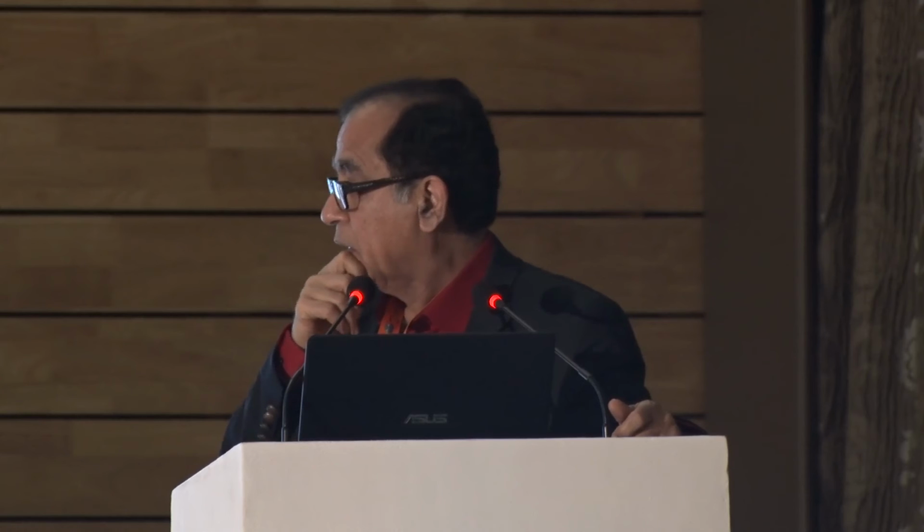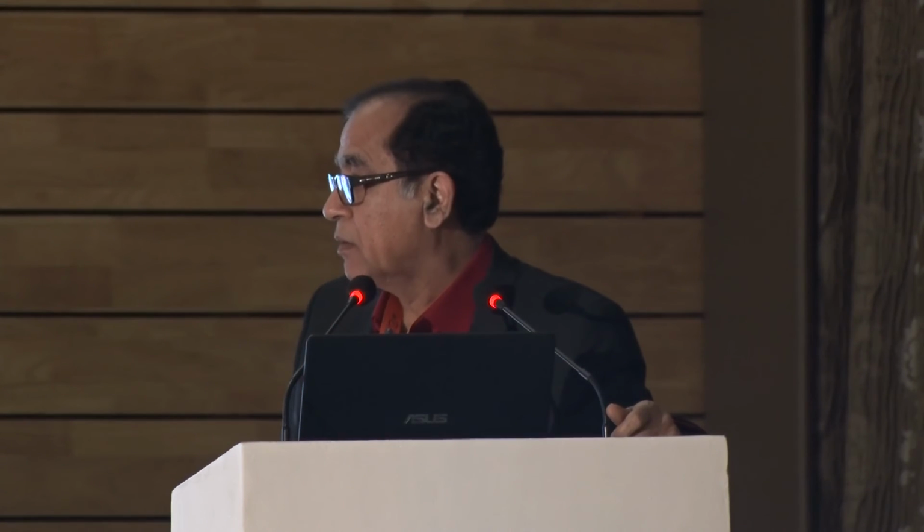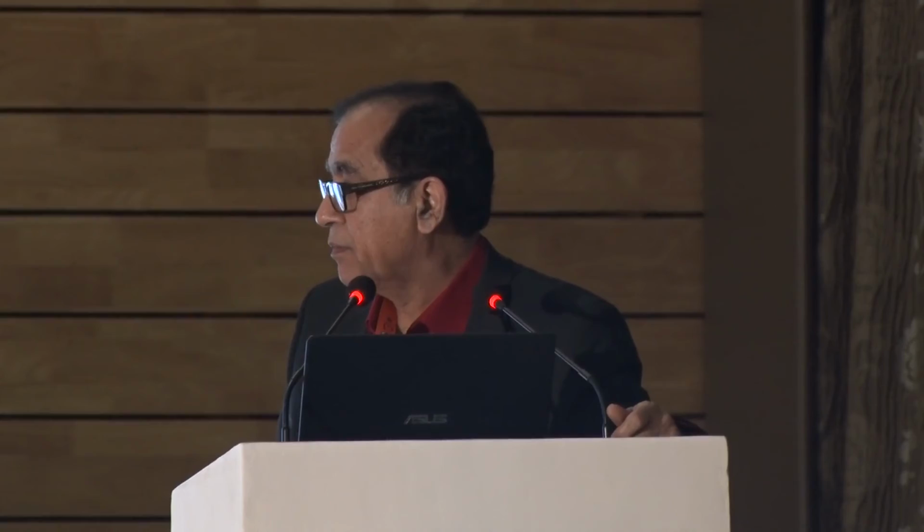Sir, it reminds me of one case, just one minute. It was a very small perforation, and fortunately the bleeding which occurred closed that perforation. I didn't do anything, and the blood absorbed on its own, and the vision was very good, because we didn't interfere with the vitreous. If there is nothing, then else you have to take a chance. Yeah, I mean, you were lucky.